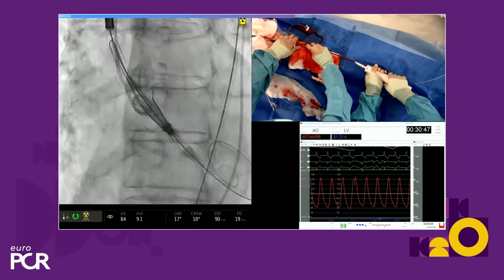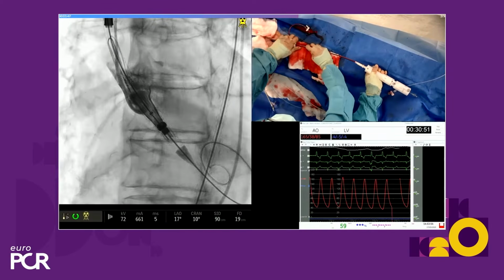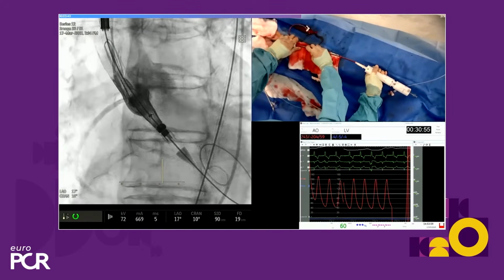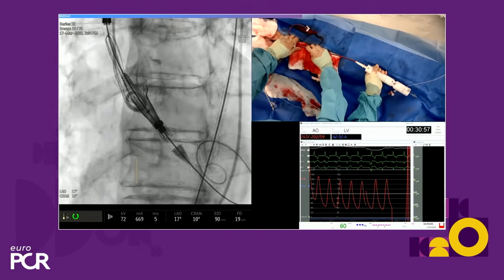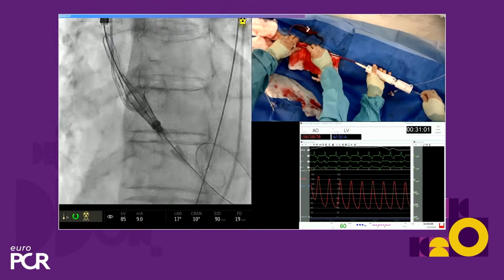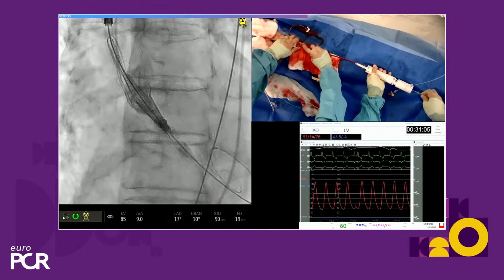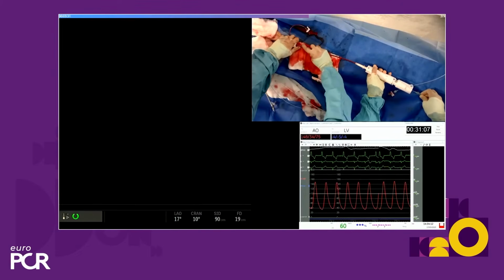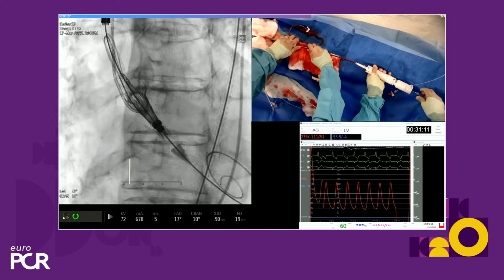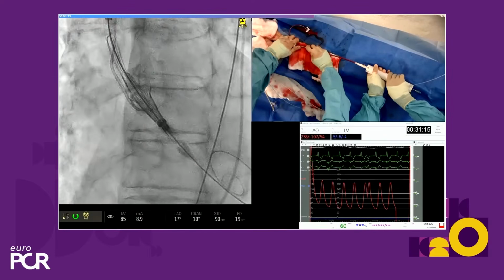Okay, so we're happy now, and we're going to start with 1A, so opening part A until you just see those upper crowns expand, checking on fluoro that those crowns are above the leaflets. Looks like we've maybe migrated slightly down, so into a more ventricular position. So at this stage we're pushing on the wire, pulling the whole valve delivery back, and then resetting with a final forward position. And that looks a better position.